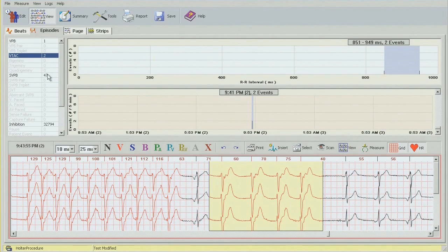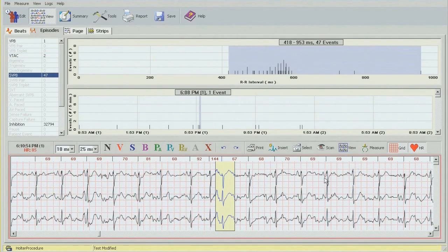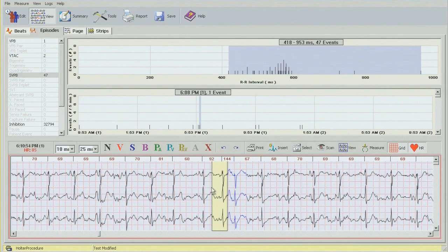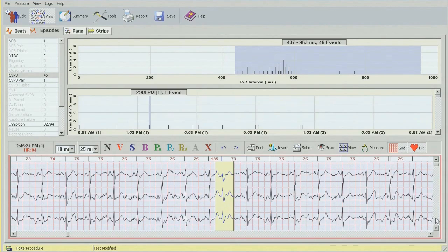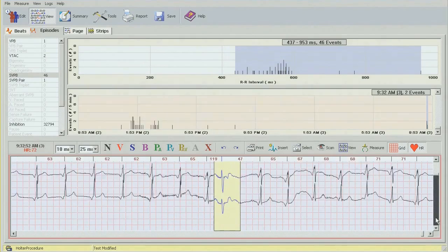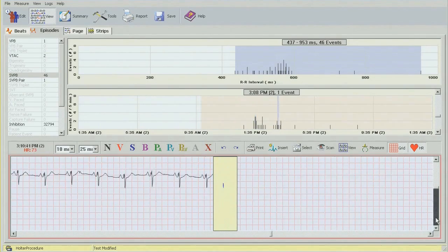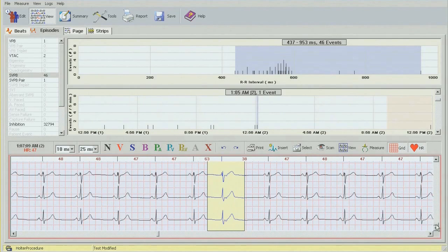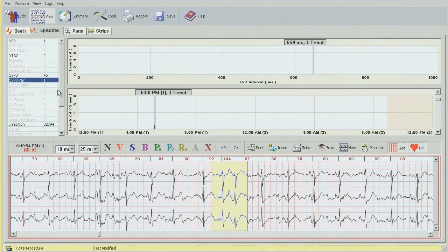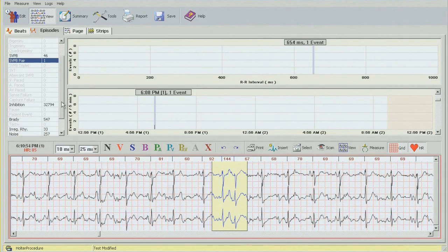Moving on to supraventricular beats. The first one I can see here is actually a couple of beats before — it's early but not labeled correctly, so I'm going to change that. Clicking through just to make sure we haven't missed anything. Everything seems to be fine — one atrial couplet which is the one we just created. Scrolling down.